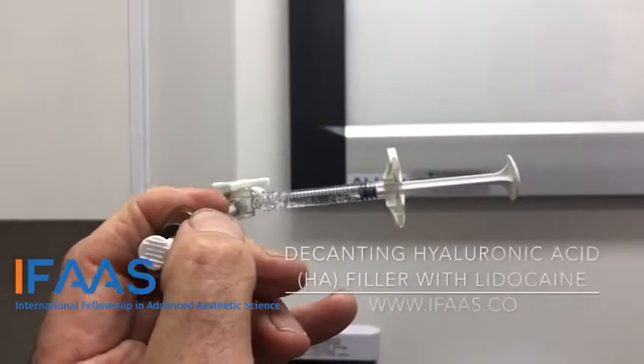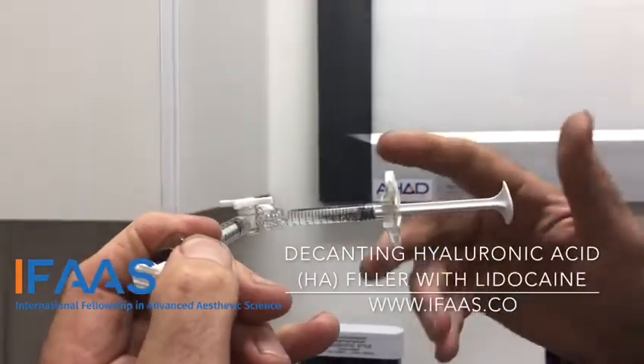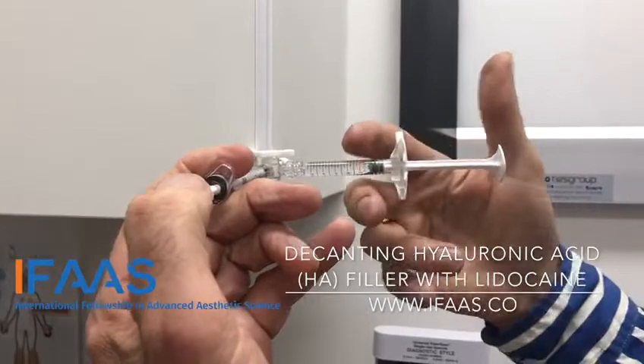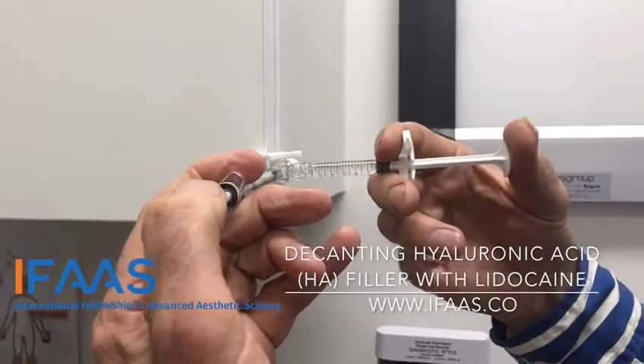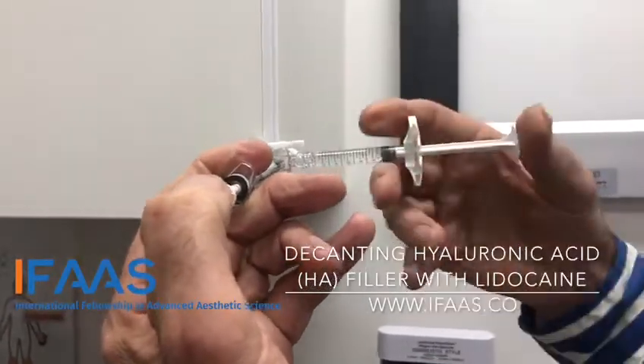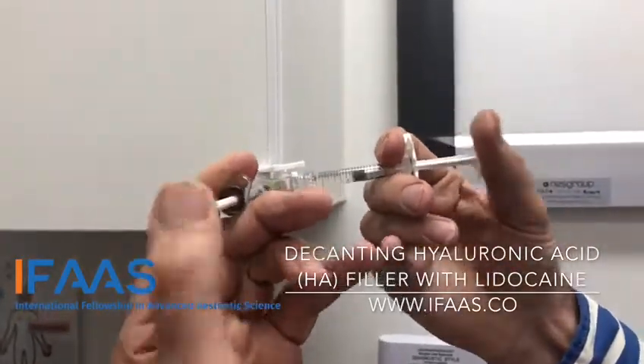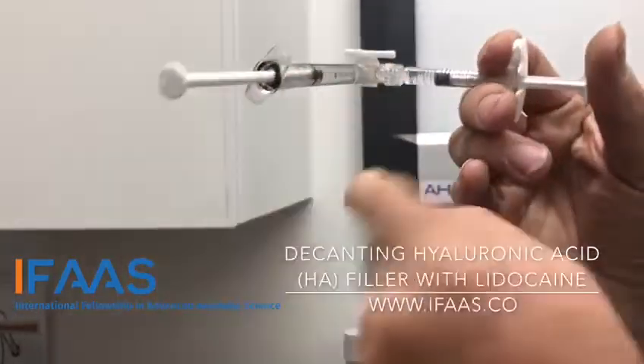We fill it with local anesthetic — there's 0.3ml of 2% lidocaine in this syringe, a 1ml syringe. We've attached our filler syringe; this is Bilatera Volume in this case. We stabilize it against the wall and move it backwards and forwards five or six times to mix the anesthetic into it, then we leave the product in this needle.